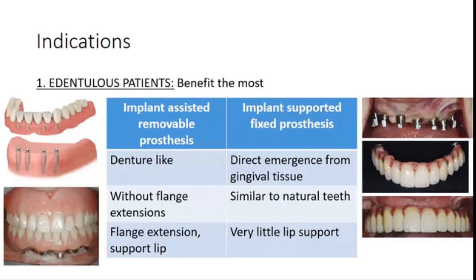They have implant supported fixed prostheses, that is direct emergence from the gingival tissue, similar to natural teeth with minimum lip support.